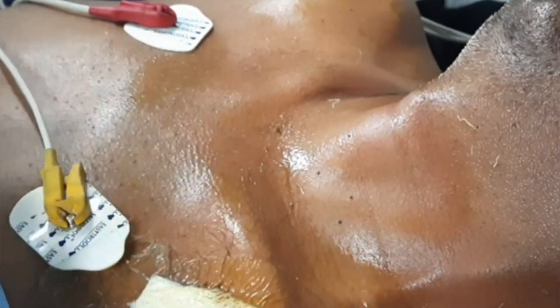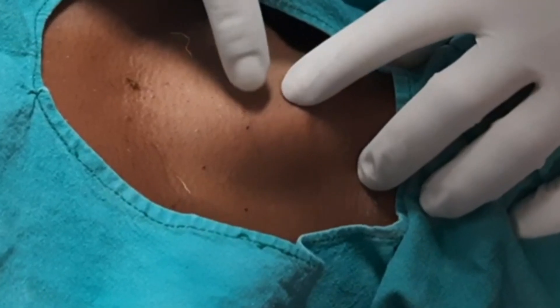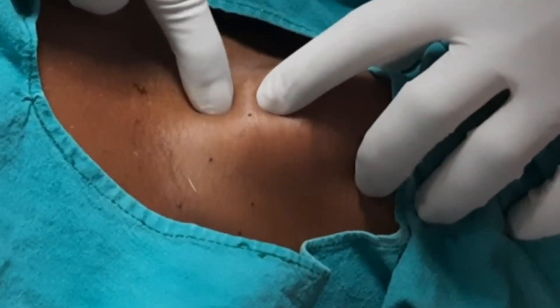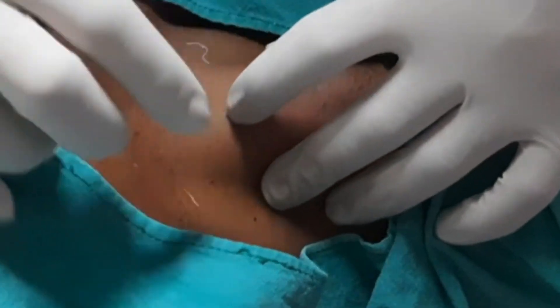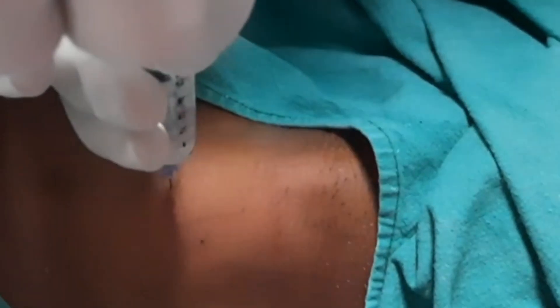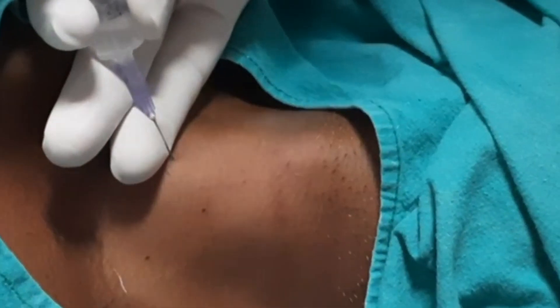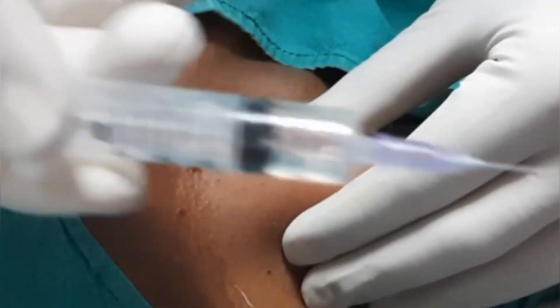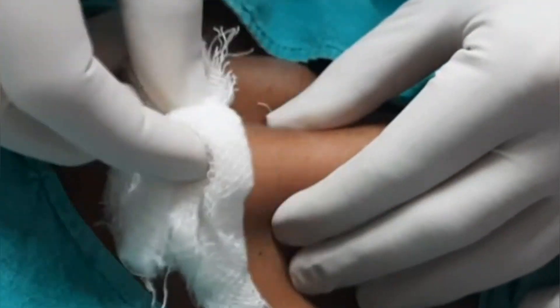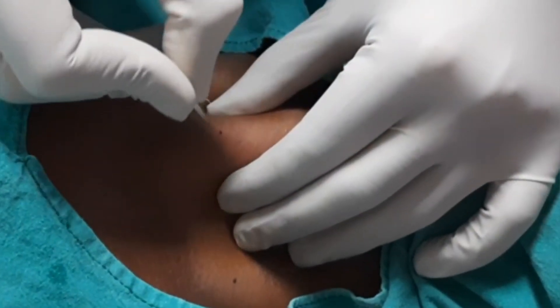Now we will take a sterile green sheet to cover the area, just exposing where we are going to insert our tracheostomy. This is the thyroid cartilage, this is the cricoid, this is the first and second space — so this is our tracheostomy site. Now we will take local anesthesia with 1% xylocaine mixed with adrenaline. We will first insert the needle and check — see, air is coming. This is our site of tracheostomy. Now we will infiltrate skin, subcutaneous tissue, muscle, and the trachea.